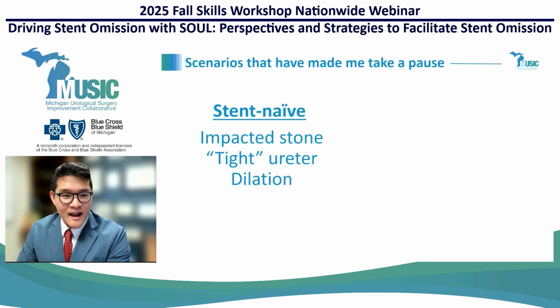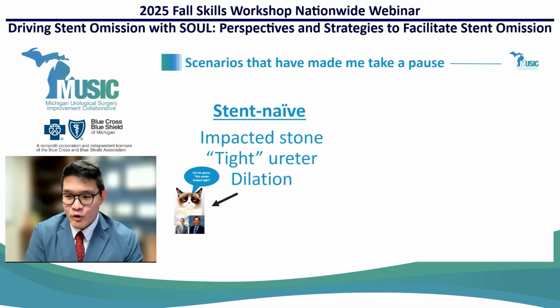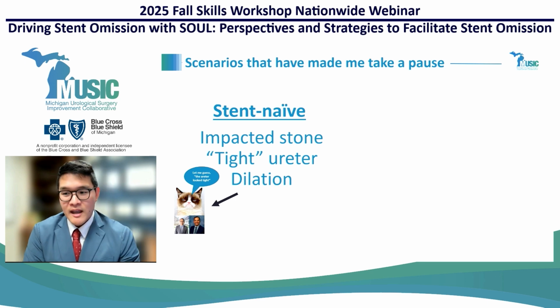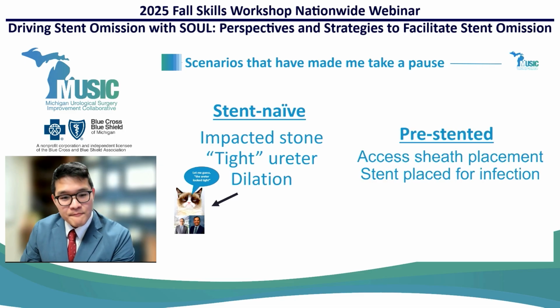I will admit not everyone is stent-free. I don't omit stents in everyone, but things that have, again, really helped is enrolling people in the clinical trial. Even when I do minor dilation, I feel comfortable putting no stent in.